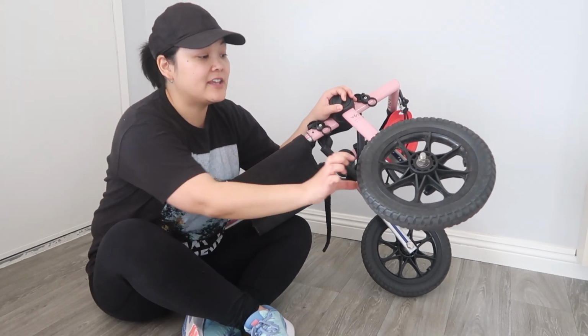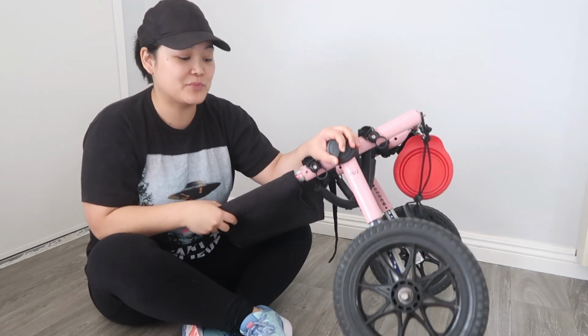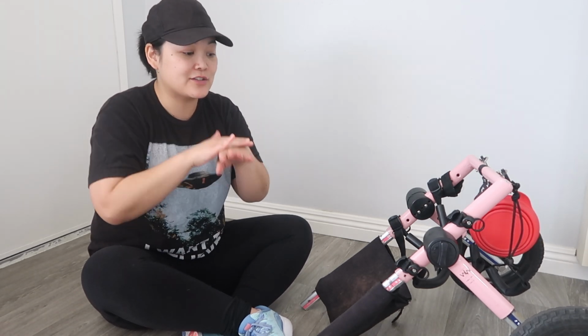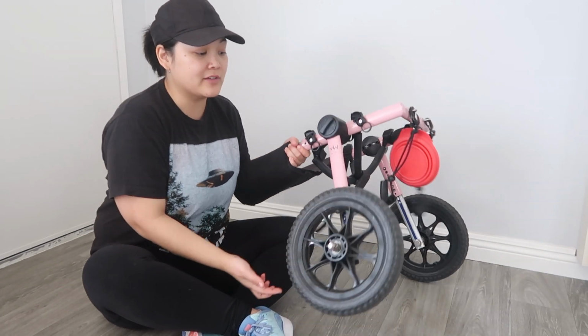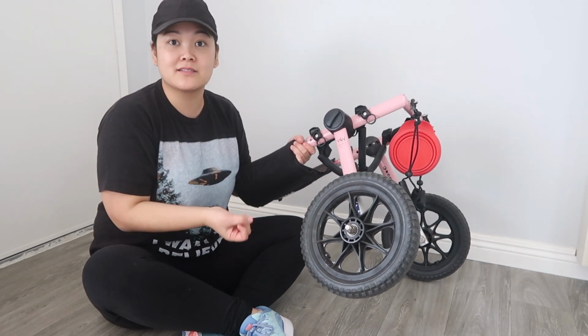But the tires we have here are actually styrofoam, and they have been working so well, because with her regular bike wheels, I don't know what they're called, she was running those down so much because she loves running in her wheelchair. We go on frequent walks, so she was really rubbing down those tires, and we would have to replace them literally every 6 to 12 months. So we were constantly having to replace those. But then we tried out these styrofoam wheels, and we have yet to replace them. They have been awesome. They don't pop because there's no air in them.